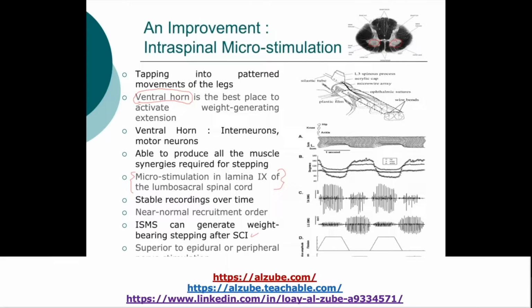So epidural nerve stimulation is the one that I mentioned before this slide, and peripheral nerve stimulation is actually the first generation where we measured EEG from surface electrodes, and then we stimulated, let's say, lower extremity muscles using other surface or internal electrodes. So the intraspinal microstimulation is very effective in overcoming the challenges and the shortcomings of the previous generations.